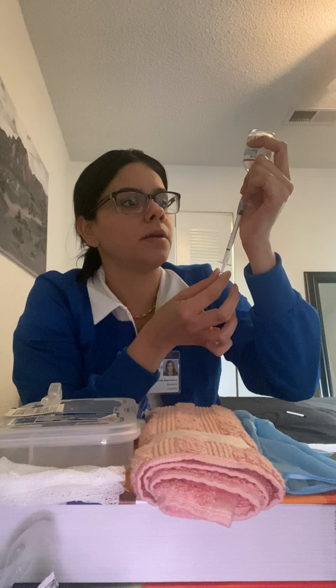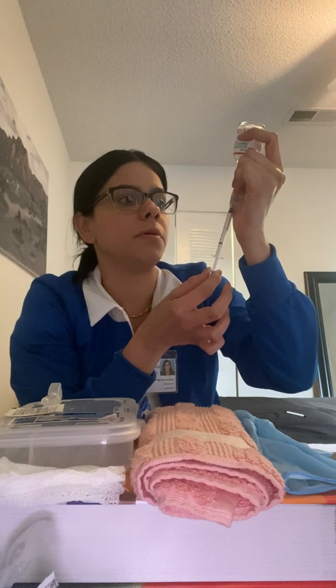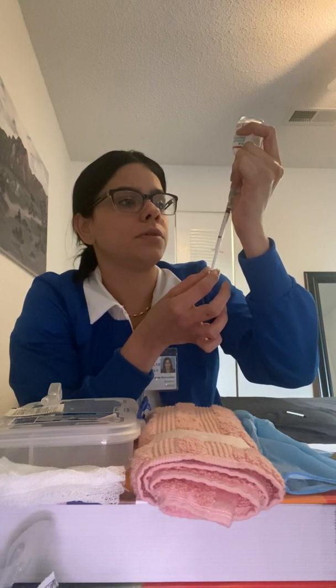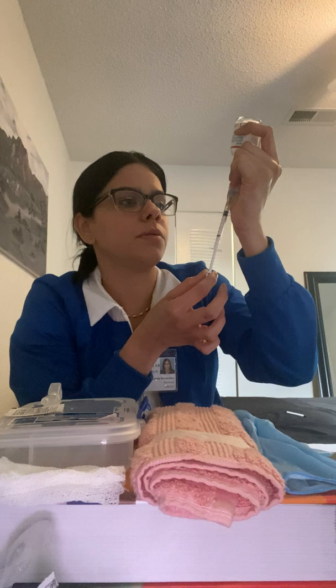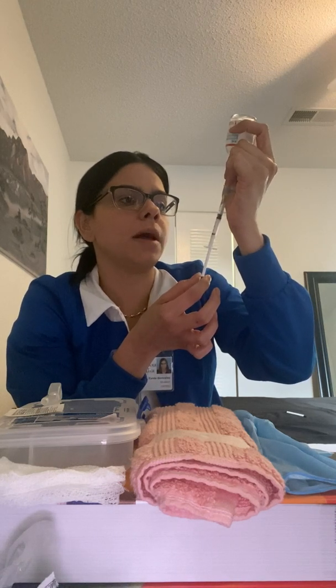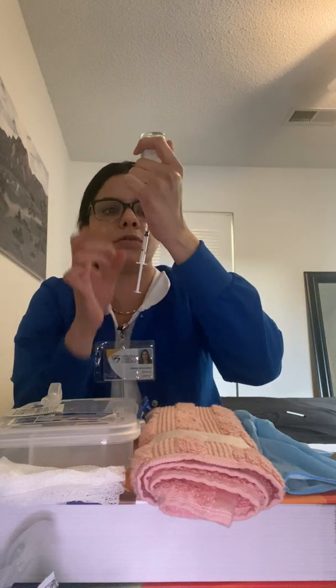Okay, so this is the tricky part, because many times we can encounter bubbles, and it's normal. So 0.4, and maybe I can draw back a little bit more than 0.5 just to help myself to get rid of all those bubbles.